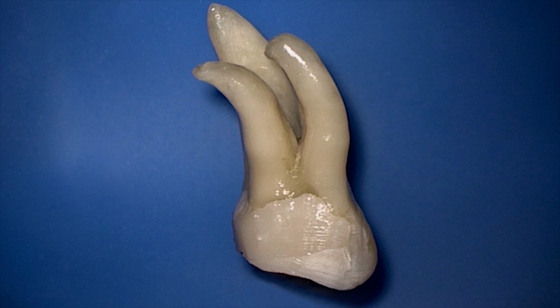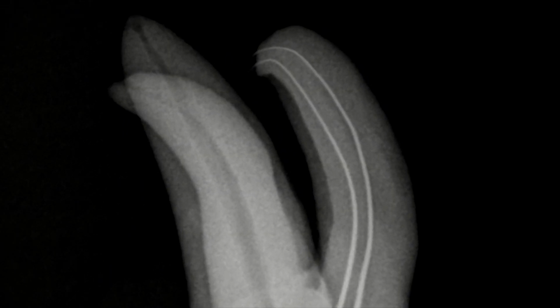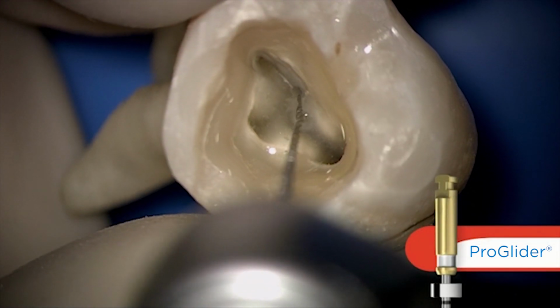Now the roots look relatively simple. You notice a little bit of curvature and maybe even abrupt curvature, but remember, the canals are more curved than the roots that hold them. Quite a bit of curvature in the apical third.